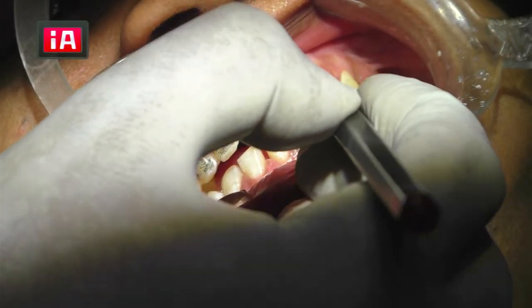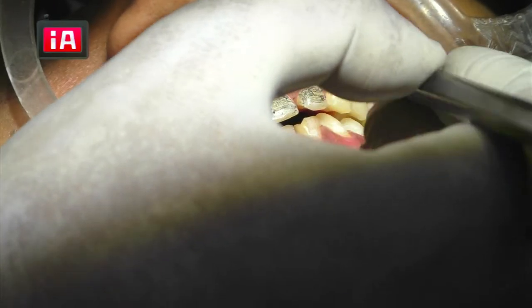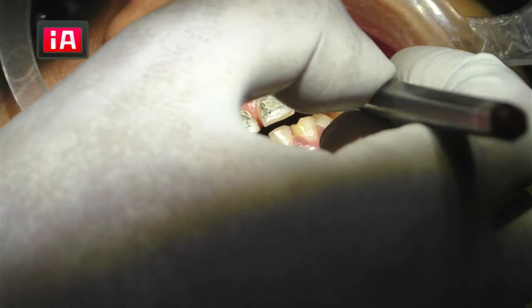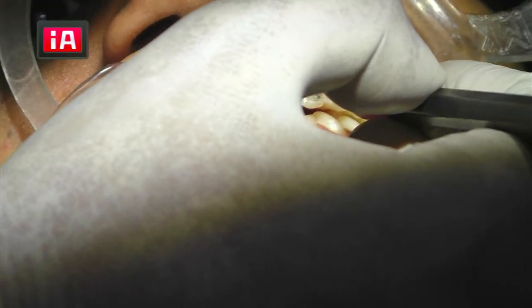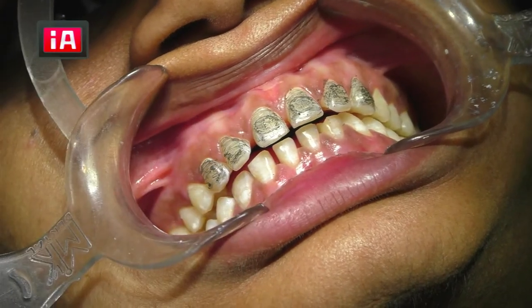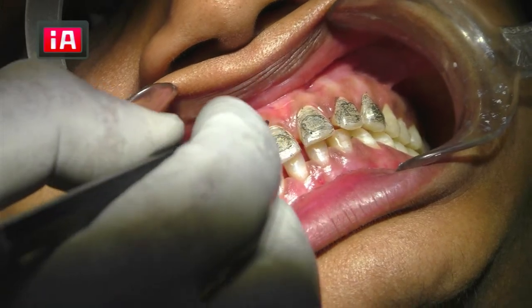This preparation is very technique sensitive. You have to have complete control within your handpiece, because if you cut too much, it is irreversible and the tooth will become sensitive. So this is the marking which we have done using a pencil.